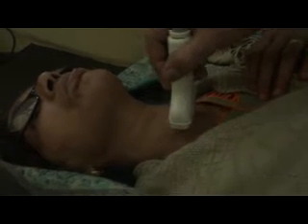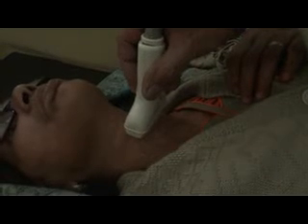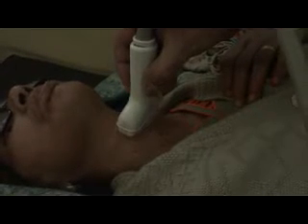From here I will see the isthmus. This will give me the transverse section of both lobes of the thyroid gland, and this angle will give me both lobes in the longitudinal sections. However, a little variation in scanning with different patients will be required. So let's start the scan.